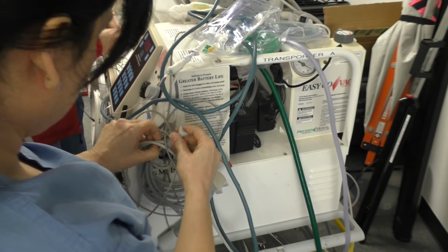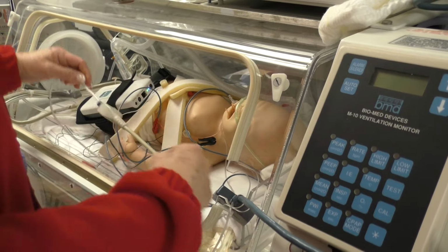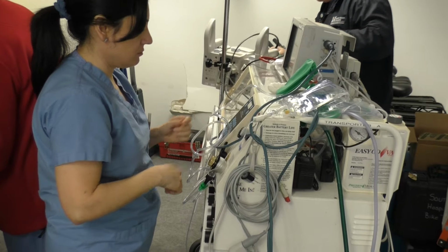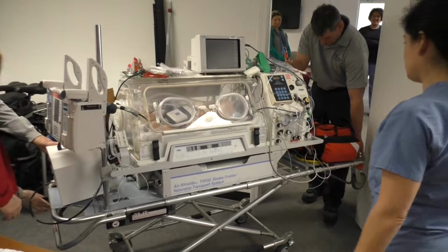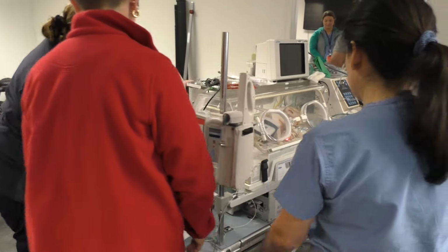Take out the needles, take out the stuff that you need to do, and practice with the equipment and utilize the equipment. And I think it makes people a little more comfortable, like with the IO drill, with intubating the mannequin and doing that stuff. They learn where the equipment is in the bags, and in a scary situation, they're used to finding it and doing the skill that they need to do.